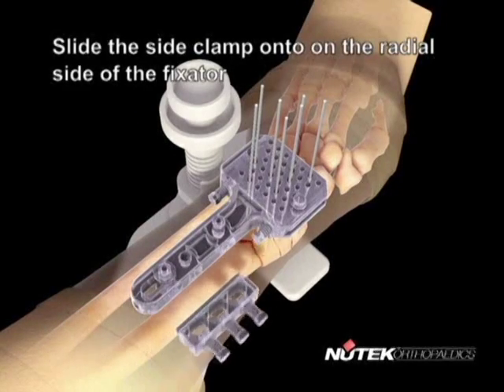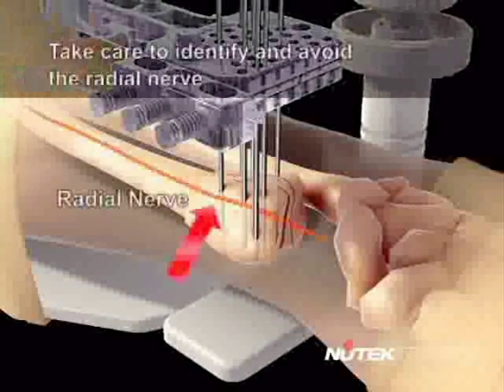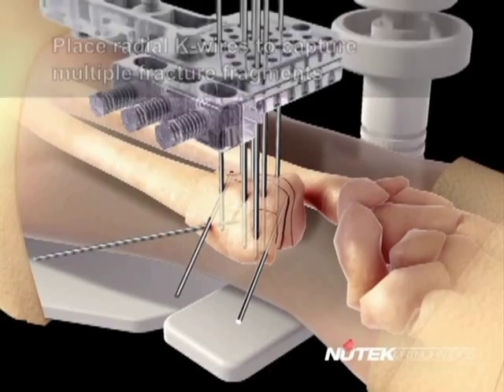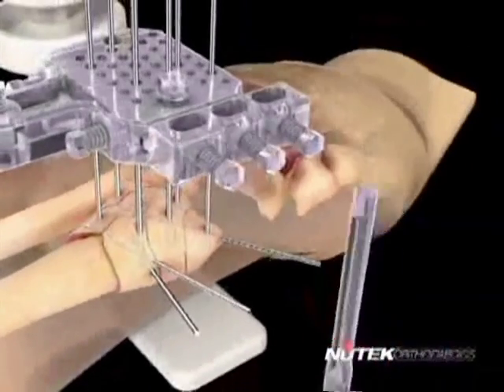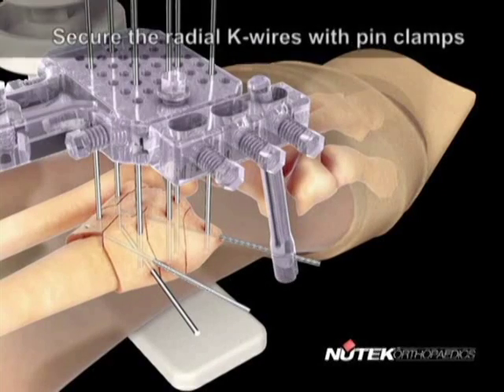Slide the side clamp onto the radial side of the fixator. Identify and avoid the radial nerve. Place radial K-wires to capture the multiple fracture fragments. Secure the radial K-wires with the pin clamps.